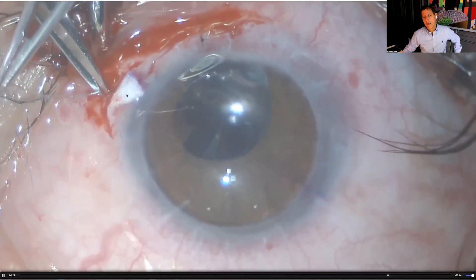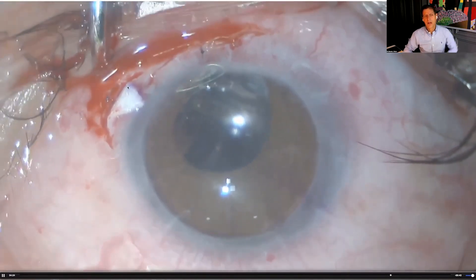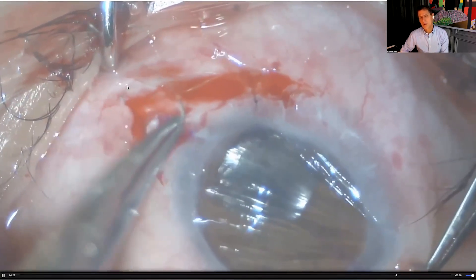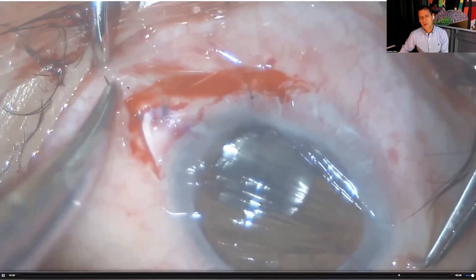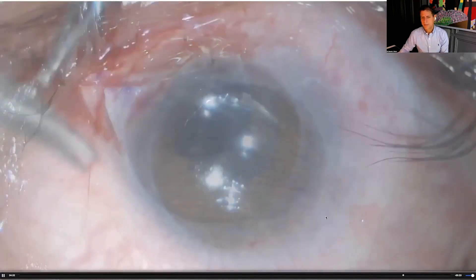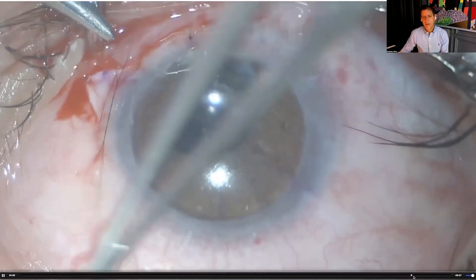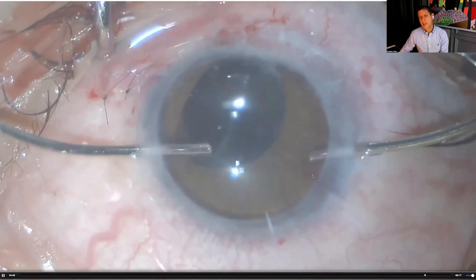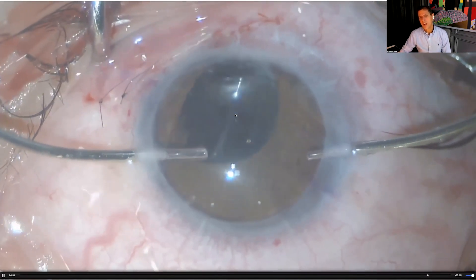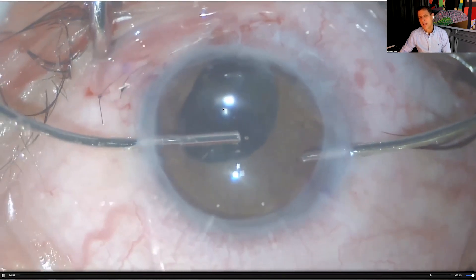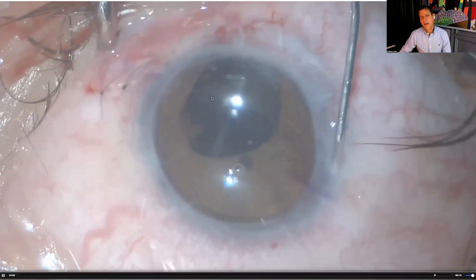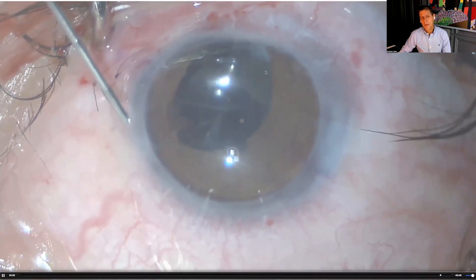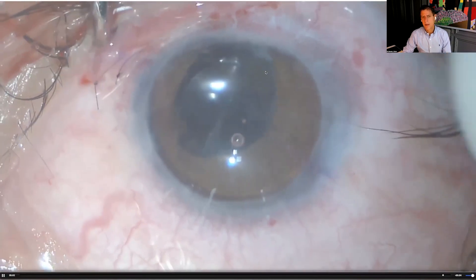We cover the knot with the scleral flap, which closes easily with one 10-0 nylon suture, then close the conjunctiva. Aspirating viscoelastic confirms the lens sits very well in place. If I did this case today, I would probably also suture the pupil for a better aesthetic result.